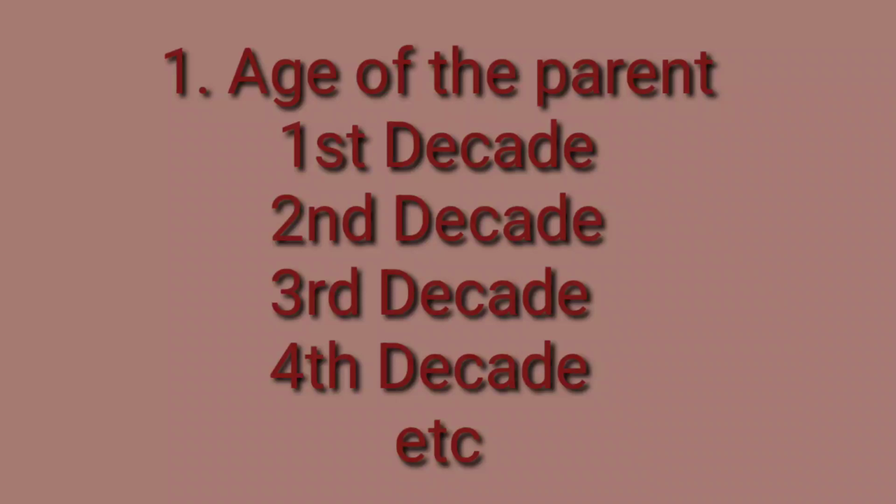While you are starting to evaluate the bone tumor on the x-rays, always ask for the relevant history, especially the age. So always look for the age, and for any changes of the bone related to a skeletally mature or a skeletally immature patient, and always look for the fusion of the growth plate.